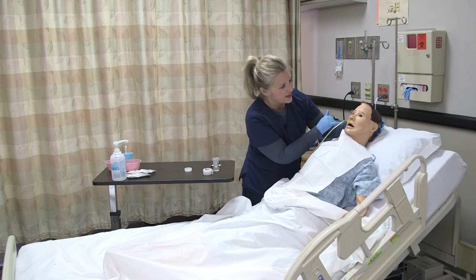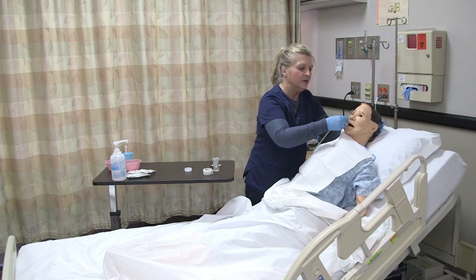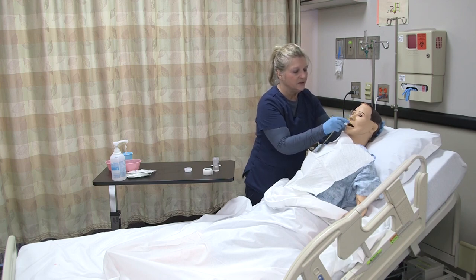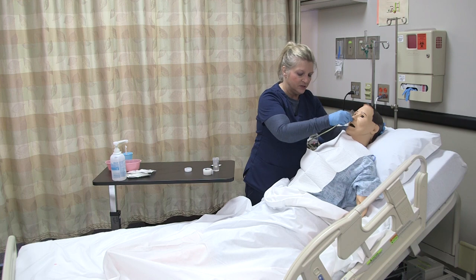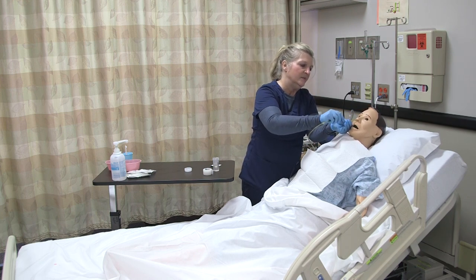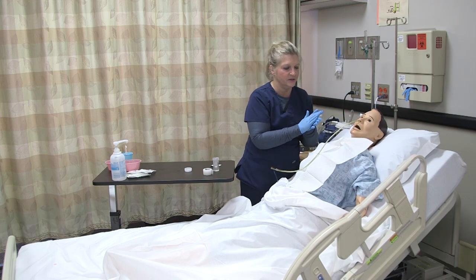If you start to notice when you get past the nasopharynx into the oropharynx that the tube starts to curl or coil near the mouth or throat, you can rotate the tube as you're advancing and that might help alleviate that. You're steadily inserting, watching for any signs of respiratory distress such as coughing, inability to breathe, or the patient signaling you to stop. Insert it to the point you measured. I'm exactly where I measured it, so I'm done. Continue assessing your patient and making sure they're doing okay.